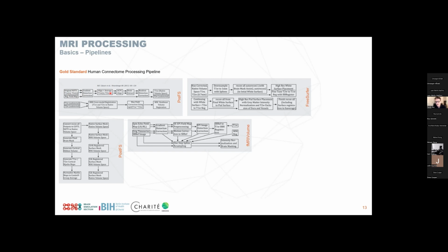And then if we have, for example, multiple T1 images, which can be the case, we want to make sure that even the T1 images are in the same space, right? Because even between those data acquisition protocols, we might have movements, right? So we might have these slight differences. And if we're talking about these very high resolution images, that might make a huge difference.